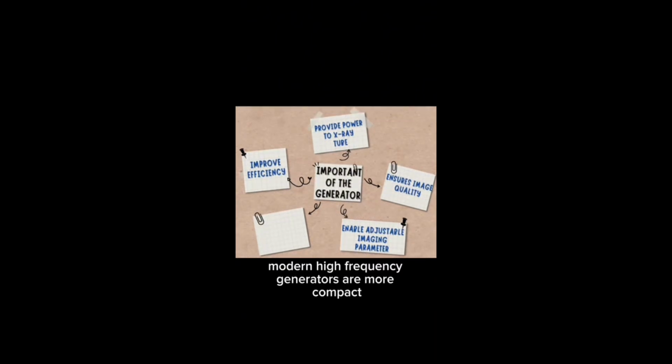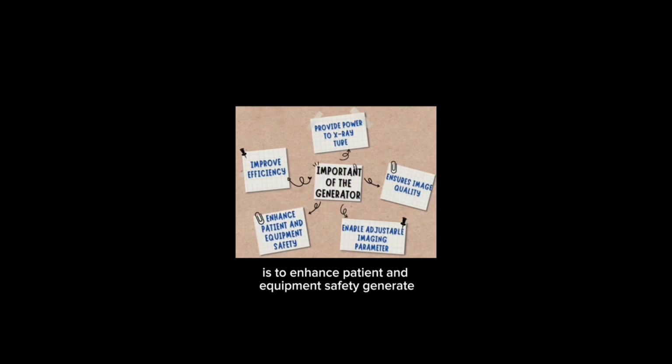Next, to enable adjustable imaging parameters, the generator allows control over critical settings such as kilovoltage, milliampere, and exposure time. Then, to improve efficiency, modern high-frequency generators are more compact, efficient, and energy-saving compared to single-phase or three-phase generators. Last but not least is to enhance patient and equipment safety.